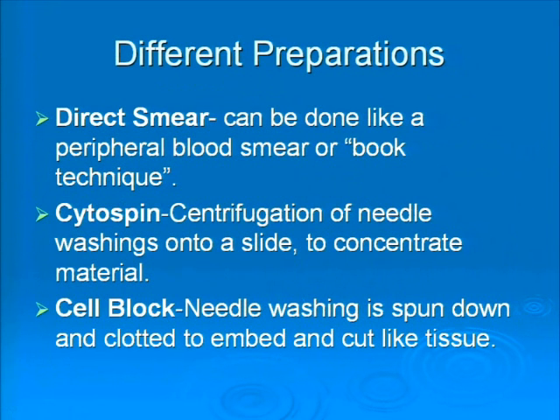All right, so there's lots of different ways that you can prepare the sample once it comes out of the patient. The gold standard is to make smears, all right? And smears can be exactly that. They can be where you take the sample and you smear it out. The gold standard truly means glass slides that you make at the time that you're doing the procedure. We're going to show you another real quick method right across the hall, and I'll go through it briefly here. It's called a book method or a pop-apart method.